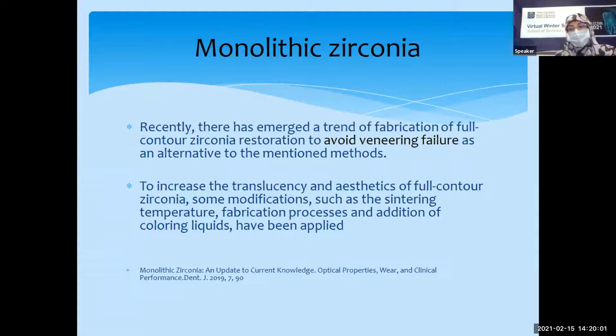Okay, to avoid veneering failure from the mentioned methods, recently there has been a trend toward the fabrication of full contour monolithic zirconia. For increasing translucency and aesthetics of full contour zirconia, some modifications such as sintering temperature, fabrication process, and addition of coloring liquid have been applied.